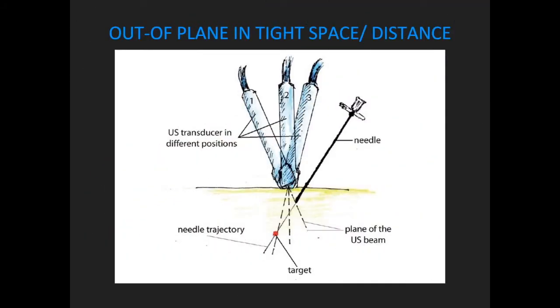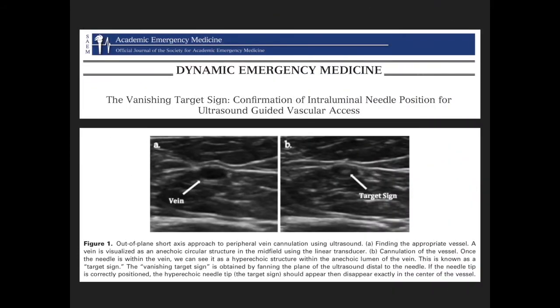In tight spaces where there is not much room to maneuver, tilting of the probe can be done to track the tip of the needle. The vanishing target sign confirms intraluminal needle position. In the out-of-plane approach, the tip of the needle seen as a hyperechoic structure should be seen throughout cannulation. Once in the vessel, the vanishing target sign is obtained by fanning the ultrasound distal to the needle — if correctly positioned, the hyperechoic needle tip should appear then disappear exactly in the center of the vessel.